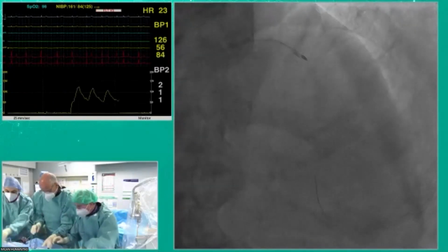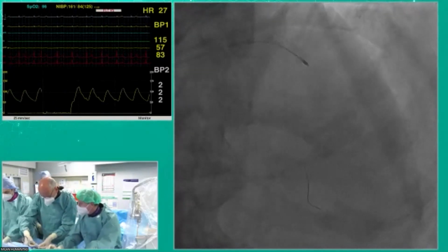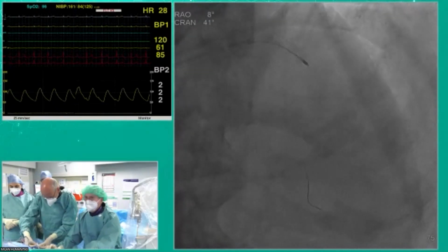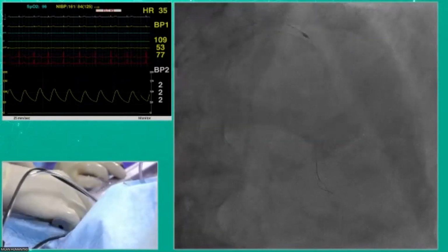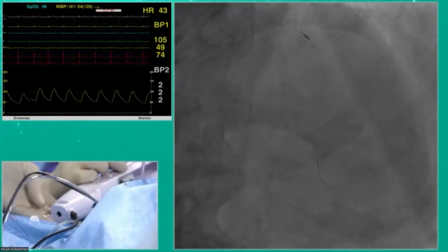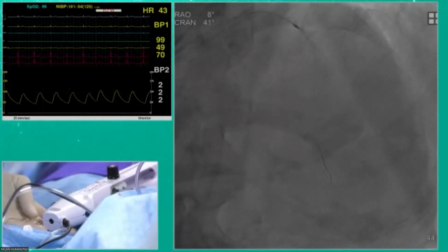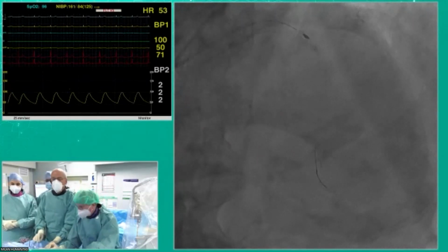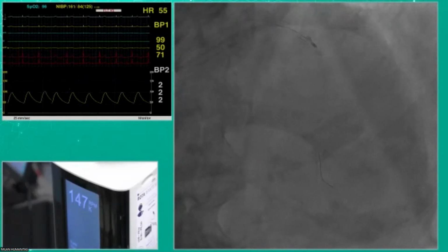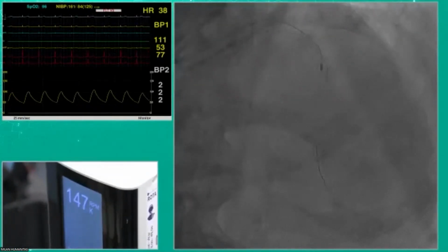Okay. Let's go here. Remove the DynaGlide. Okay. Let's do a film. I think we are in the proximal stenosis. Bernard, if you see that the wire tends to come back, just push it distally. And what burr speed? I can see it. So about 150? Yeah, can you go a little bit distal with the wire?